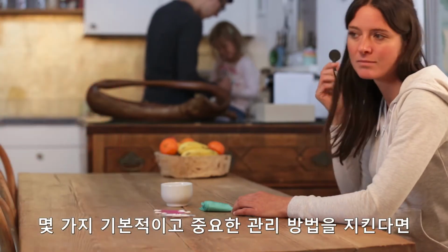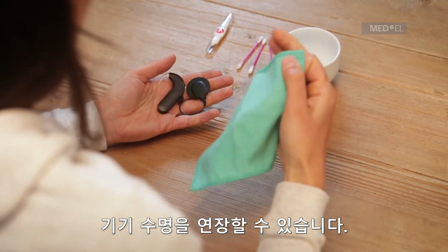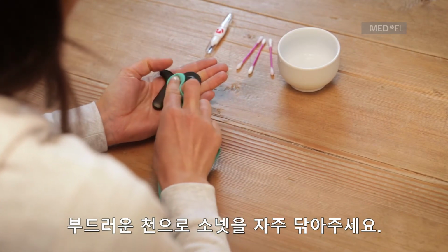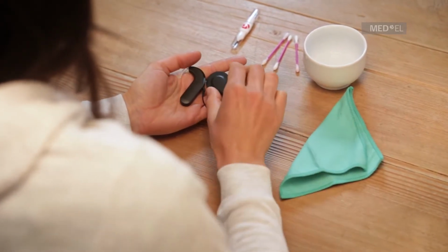By following a few basic and important care instructions, you can help improve the functioning of your Sonnet and extend its life. Clean Sonnet regularly by wiping it with a soft, damp cloth. If the microphone covers get wet, wipe them dry, use the drying kit, or replace them.